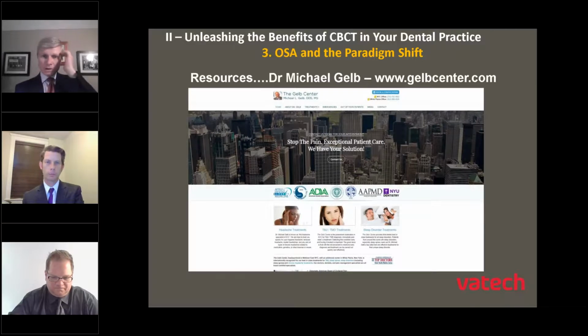All right. So among the various KOLs or thought leaders that we partner with, Dr. Michael Gelb is actually the person that I kind of borrowed this paradigm shift terminology from, because this is really the backbone of everything he does within his practice when evaluating TMJ, airway. He looks at the airway first, and then from there determines what needs to be done from an airway point of view before considering other dental treatment within his practice.